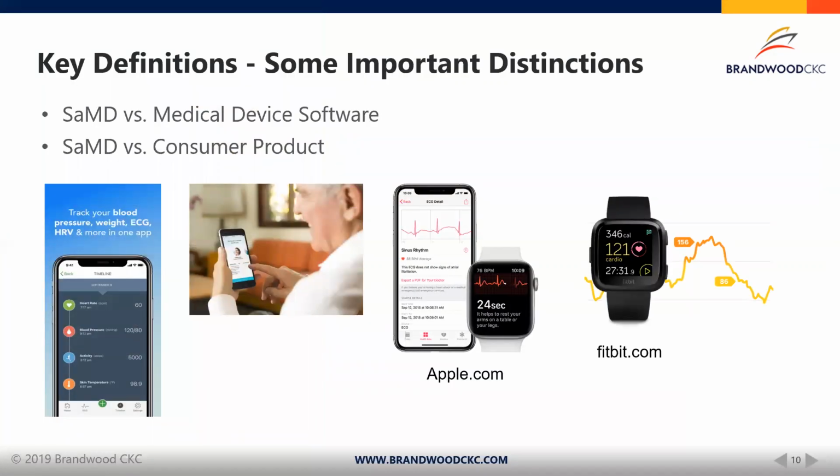Thank you, Jean. Yeah, it's a very important starting point to understanding software as a medical device or standalone software. With the explosion of various healthcare targeted products, the main challenge is knowing if your software is a medical device or not, especially given the availability of a multitude of technology platforms, as well as increasing ease of access and distribution of software created for medical purposes to be used to make clinical decisions and sometimes non-medical purposes. It is important to understand the distinction between software as a medical device and general medical device software, and also software as a medical device versus consumer products. This distinction is based on the intended purpose and the claims of the software. If it has a medical purpose, that is, it is used to make clinical decisions, then the software is a software as a medical device or standalone software. Otherwise, it can be a consumer product.